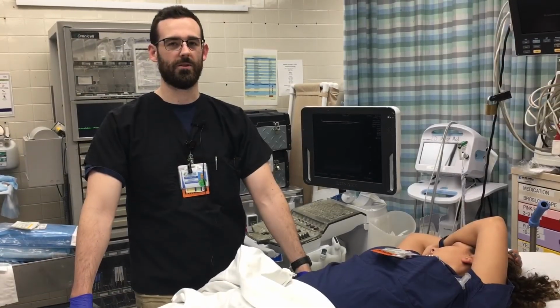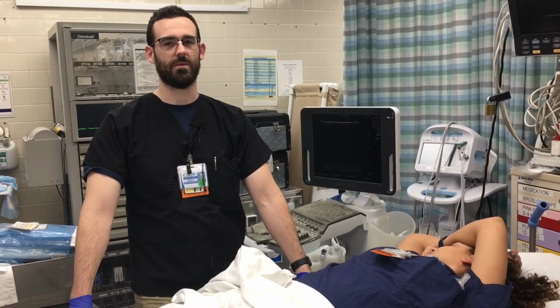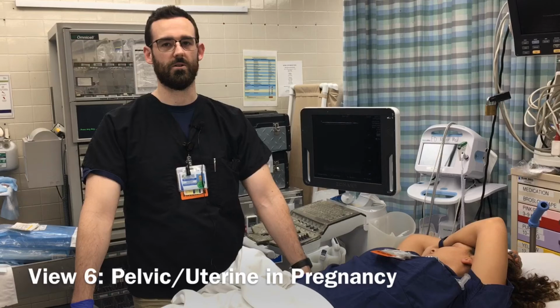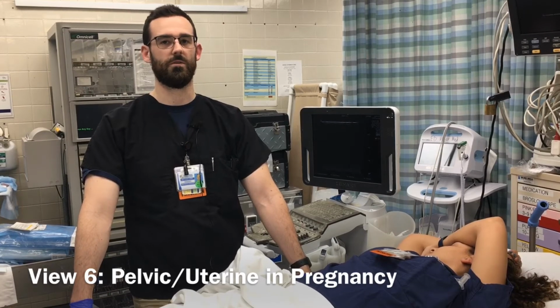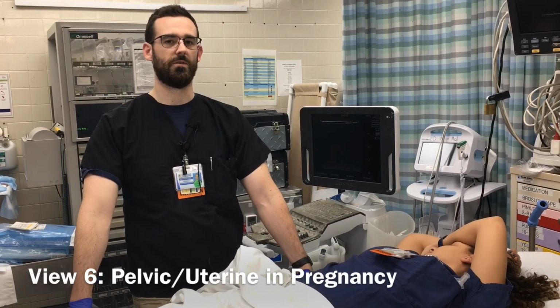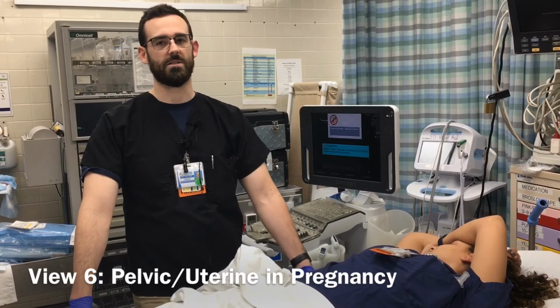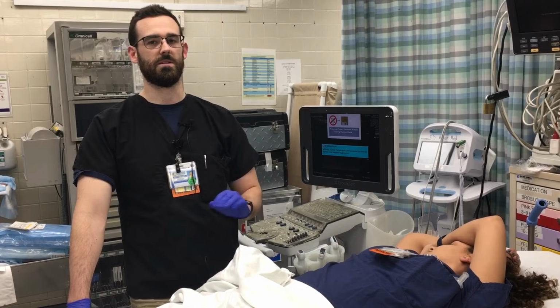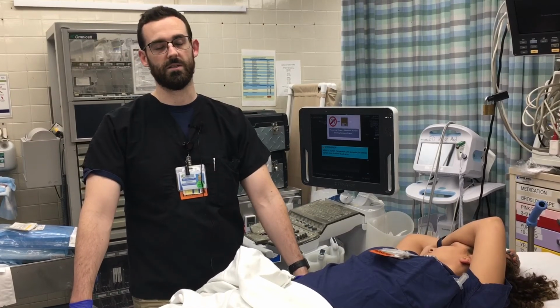Another thing you can do with ultrasound, especially with abdominal trauma, is pregnant females coming in. You want to make sure you do a good ultrasound of the uterus and look for good fetal movement, look for a good fetal heart rate, and look for any other signs of free fluid in the abdomen, such as free fluid between the placenta and the uterus interface.